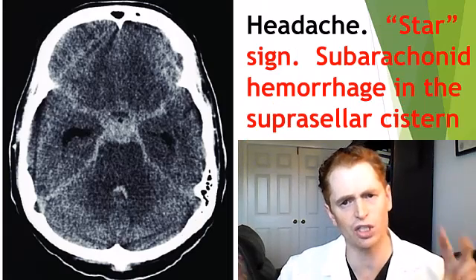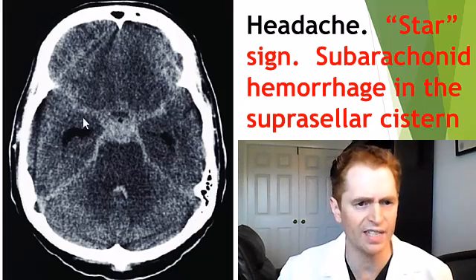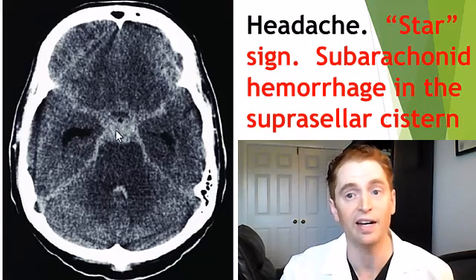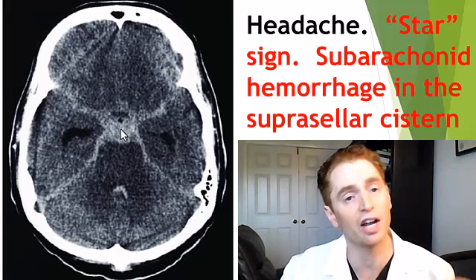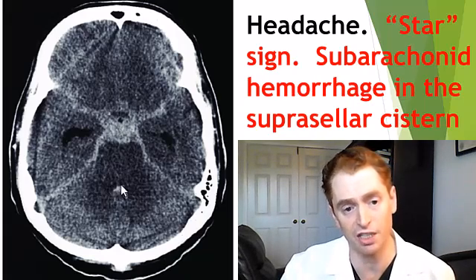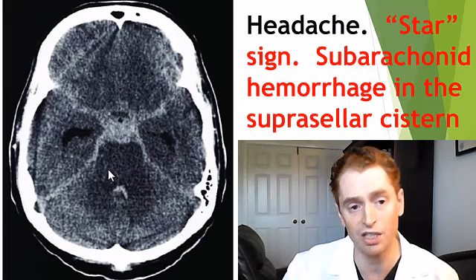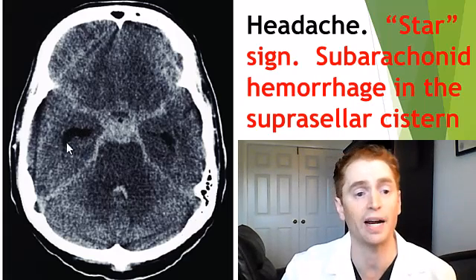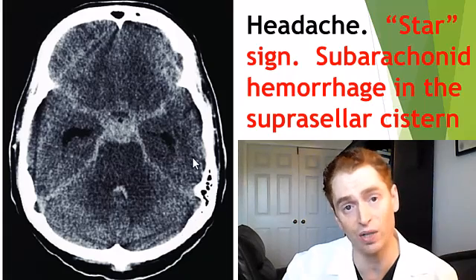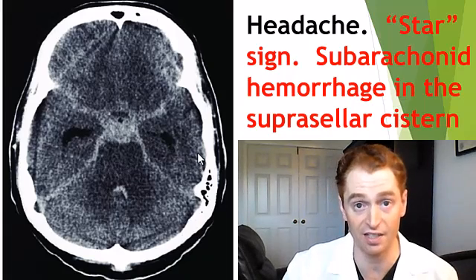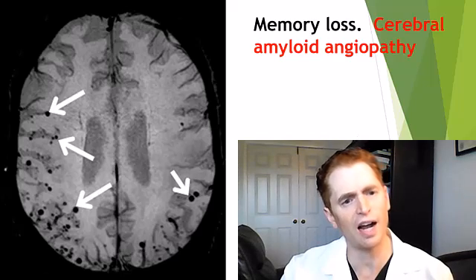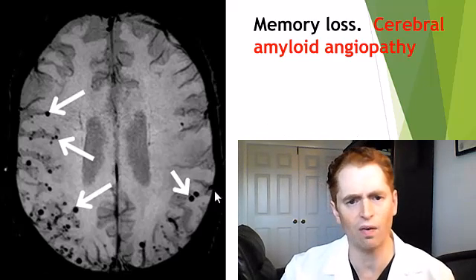This CAT scan done on someone with headache shows the star sign. This bright signal — high attenuation — is blood in the suprasellar cistern, generally from a ruptured brain aneurysm. You can also see some blood in the quadrigeminal cistern. There's also enlargement of the temporal horns of the lateral ventricles, consistent with secondary hydrocephalus.